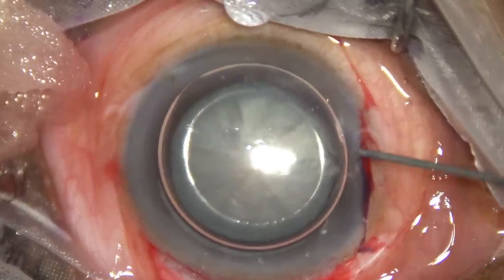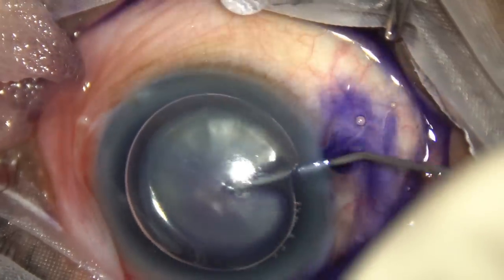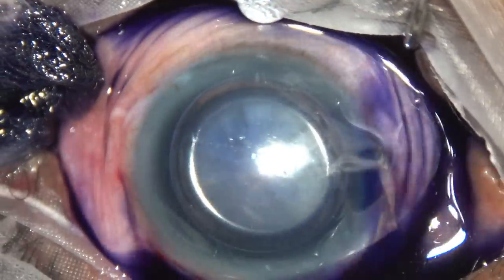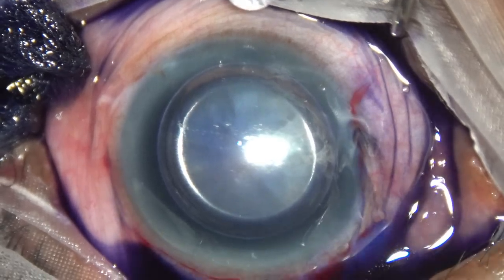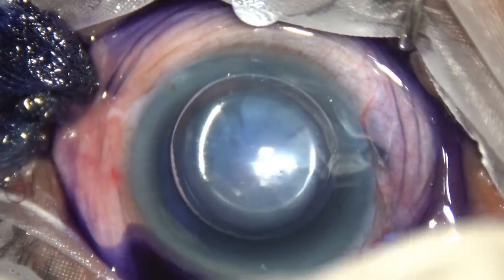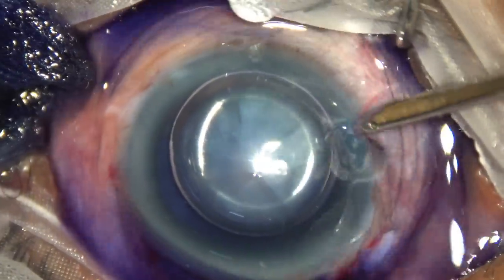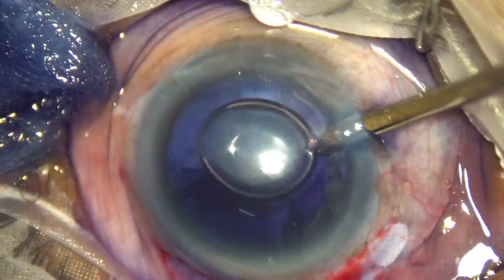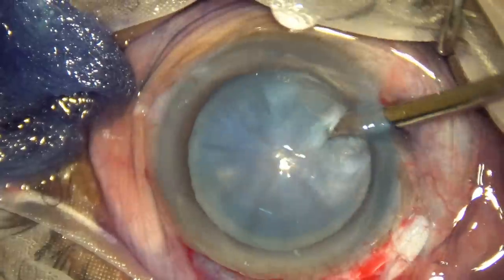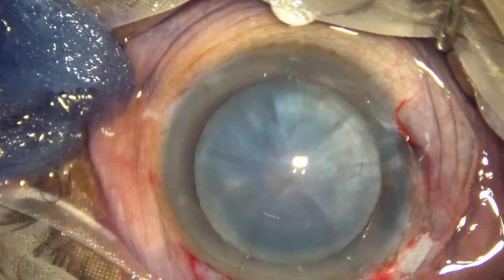This air bubble, and put dye under the air bubble. This is adrenaline. Yes, watch the dye. And fill up the anterior chamber with this.